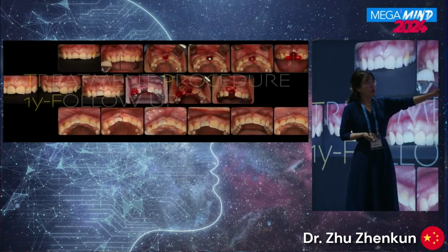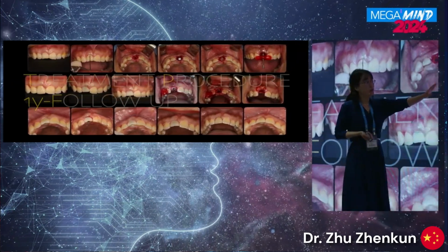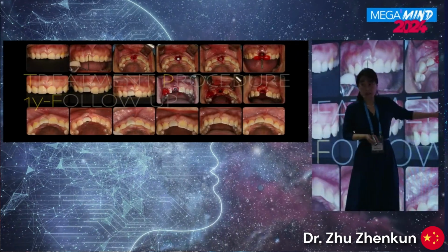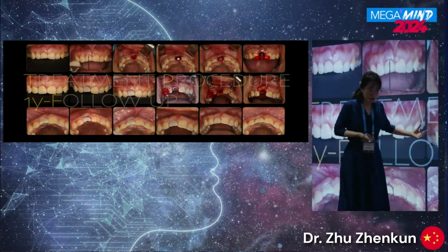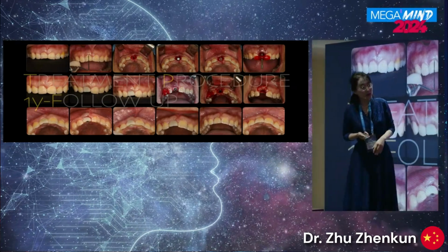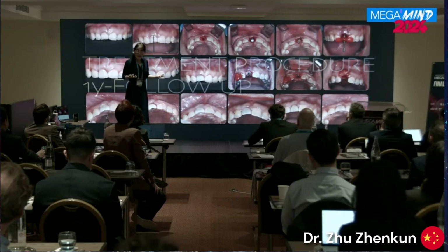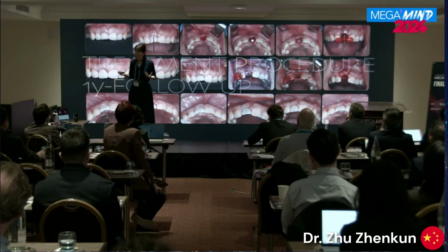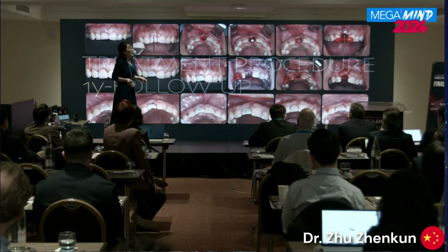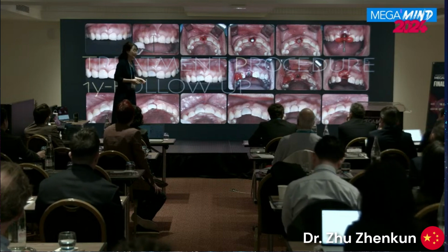First of all, we did a minimally invasive extraction. I did the immediate implant placement and the CTG, bone augmentation, and immediate restoration. And up to today, it has more than 1 year follow-up. As the patient personally said, she is very satisfied with the whole treatment process and the aesthetic outcomes.